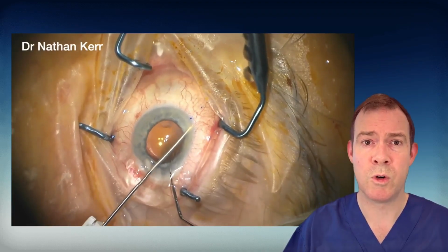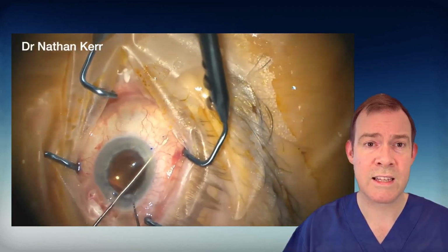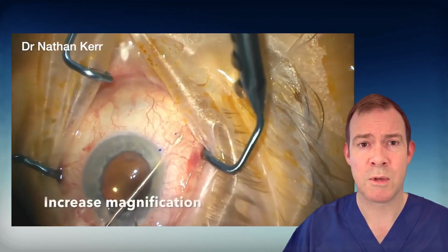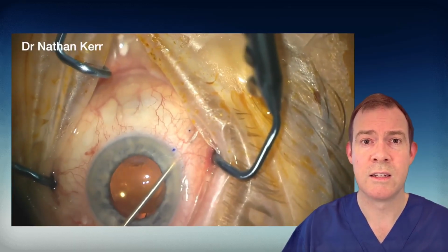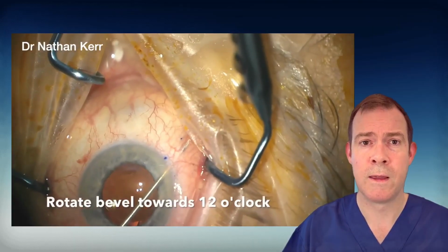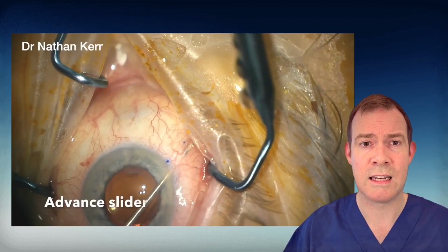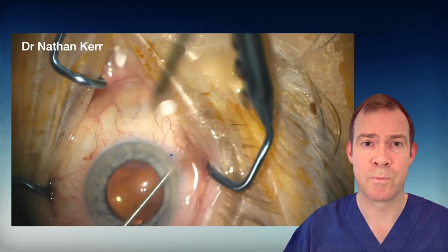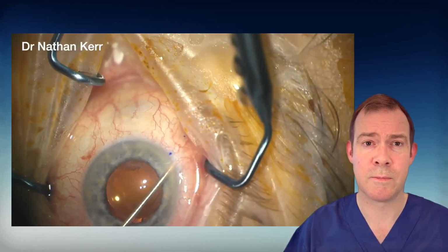Some surgeons prefer to do it under gonioscopic assistance. We want to exit the sclera no more than 3 millimeters from the limbus. Sometimes a little anterior can be helpful, so that ensures that we're anterior to tenon's insertion. We now want to increase the magnification, rotate the needle, and slowly advance the slider to deploy the XEN. And here we see the XEN deploying into the subconjunctival space.